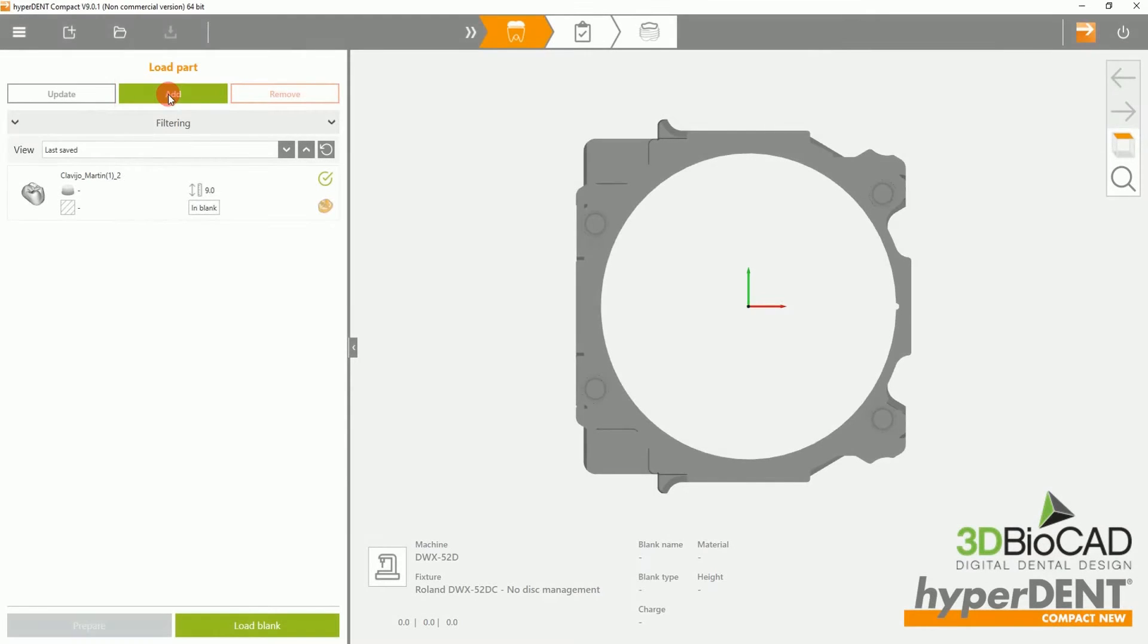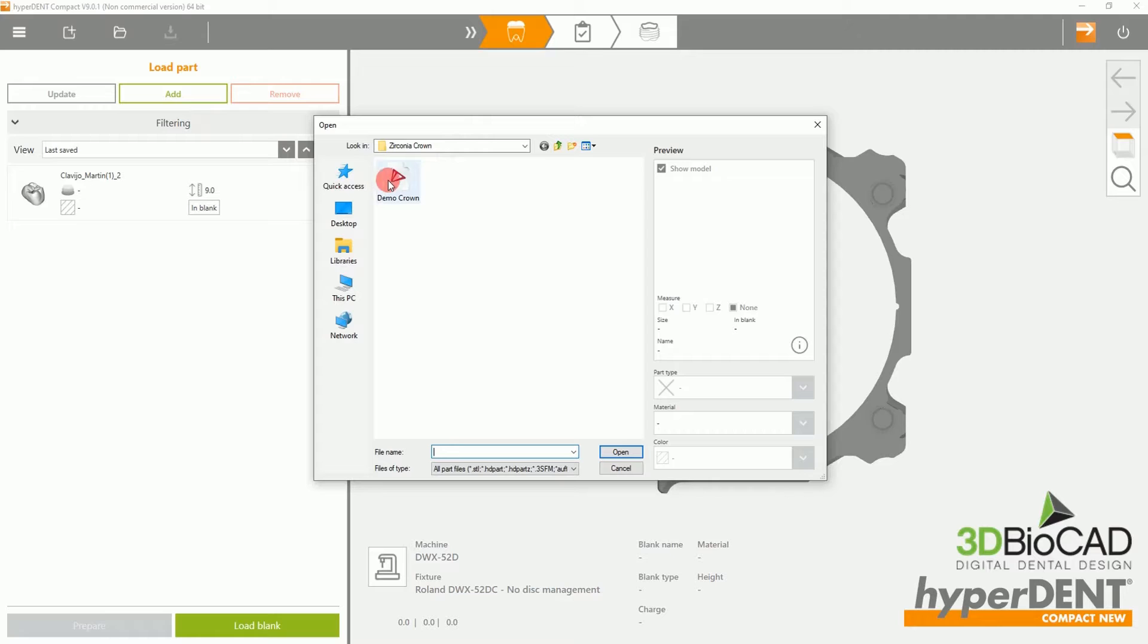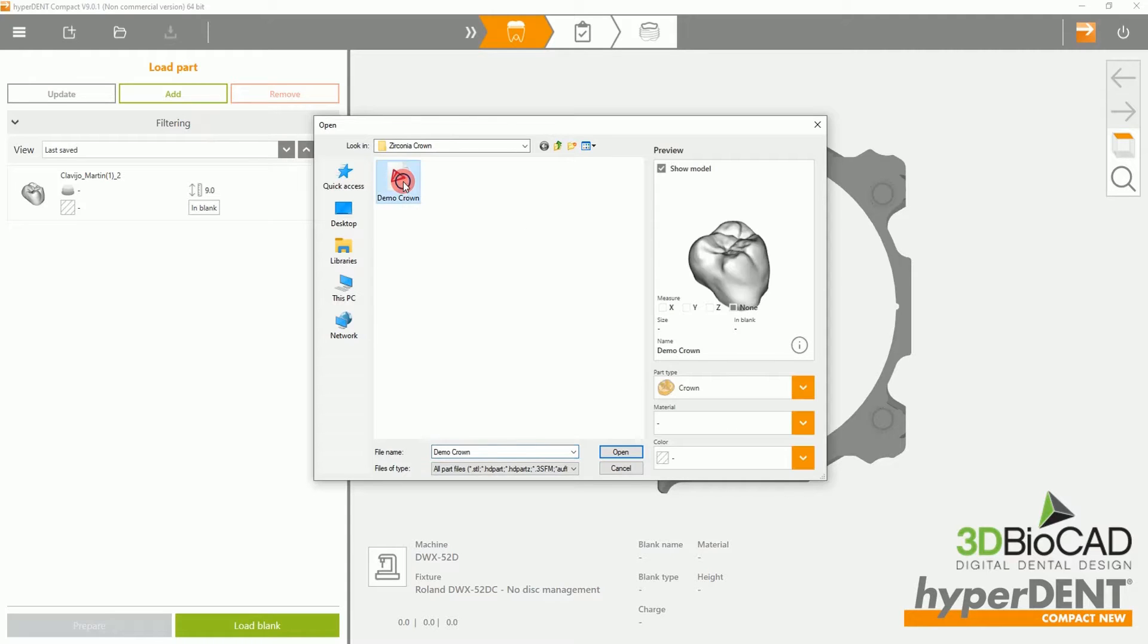To start off, please select Add to add a part. Then select the desired file.